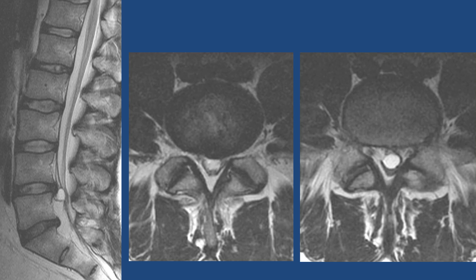In this proven discal cyst example, you can see disc herniation at this level, and below it is a lesion that raises the question of whether it's a small disc protrusion with some other abnormality — perhaps a cystic tumor. However, this is actually a discal cyst; the two are connected. You can see how bright it is on the T2-weighted image and its effect on the thecal sac with the roots visible in the subarachnoid space. That's a quick rundown of the terminology commonly used in reporting degenerative disc disease.